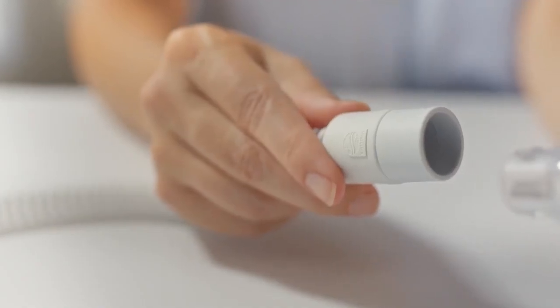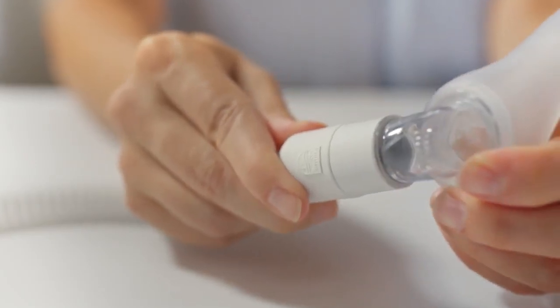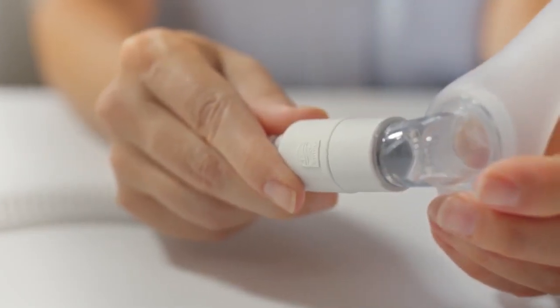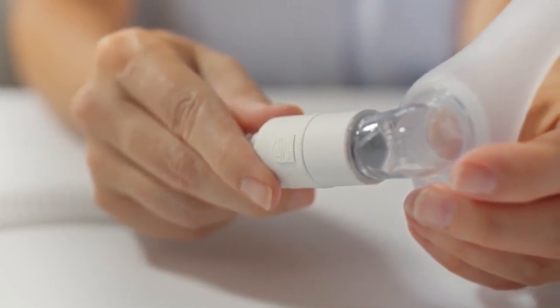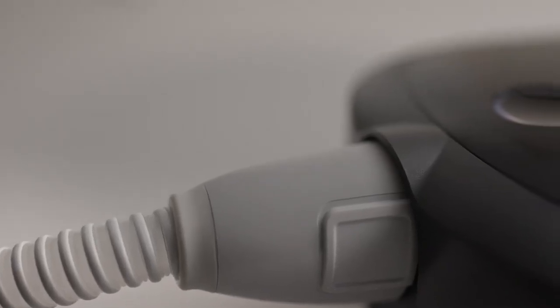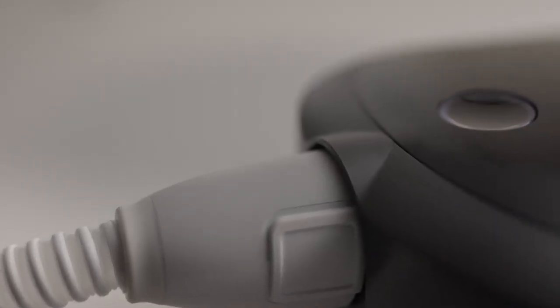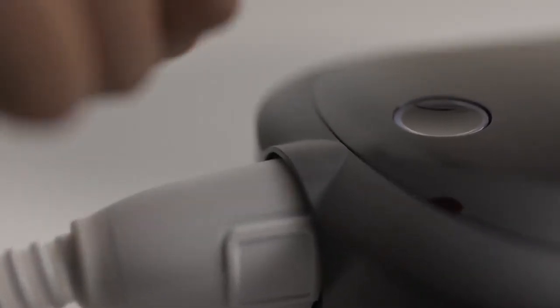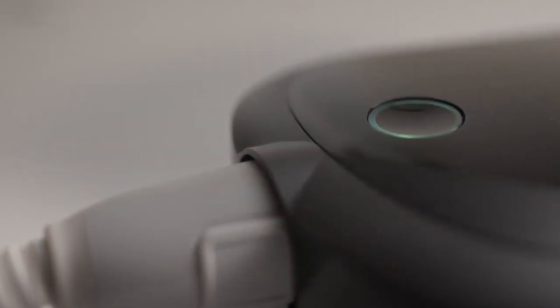Connect the tubing to your prescribed mask and position the mask on your head. Air may start flowing automatically when you breathe. If not, press the therapy button. Notice the outer ring of the button turns blue to indicate that air is flowing.